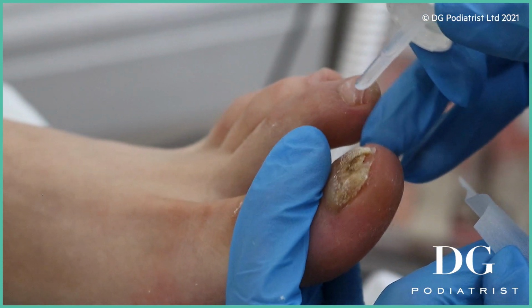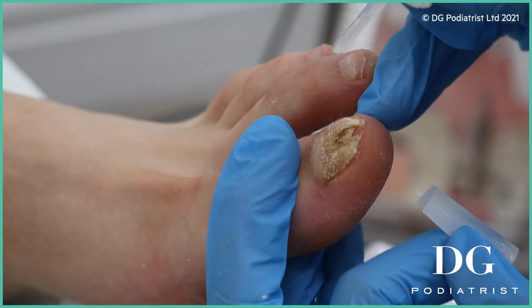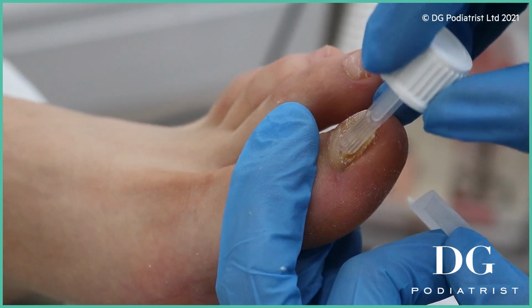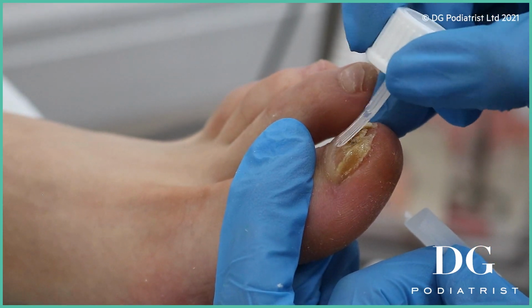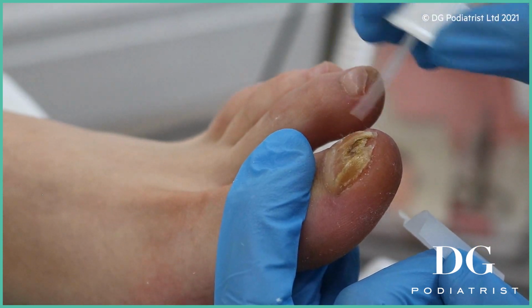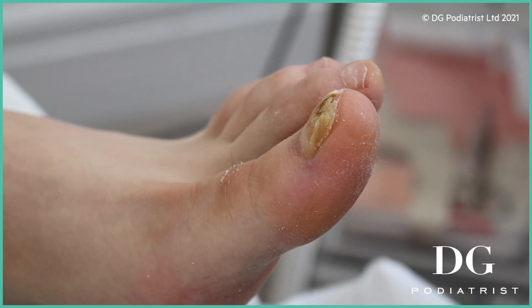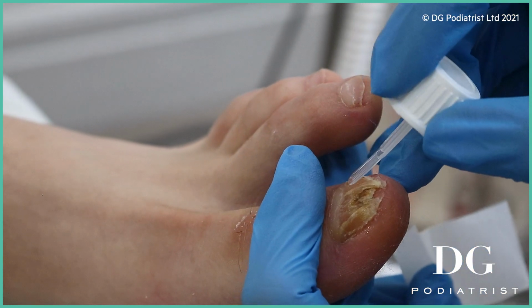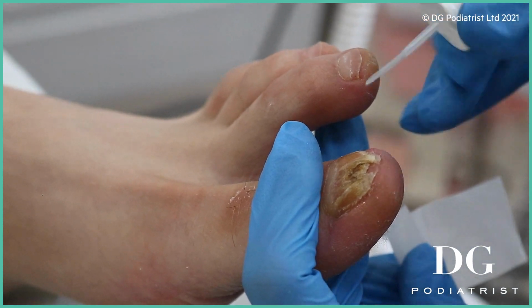There we go. Can you see the micro little tiny holes once it's all dried? Small little tiny ones there. So medicine will just sit right inside the pockets. There we go. So now when I apply it, there we go. Best case is to do this once a week, right? Definitely. Because when you're doing it once a week, you're really getting the penetration that you need. Whereas I feel like the box files just, unfortunately, don't do enough. And I've had better results with doing this with clients than with a client just going home and using the box by itself.